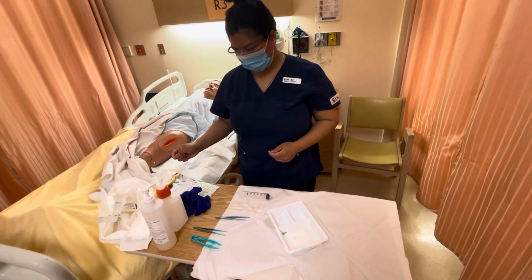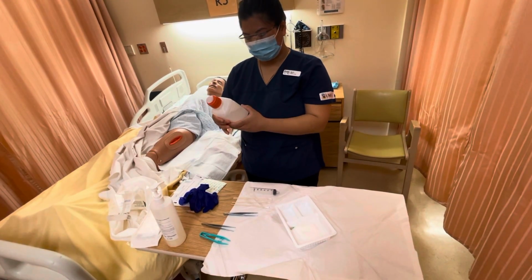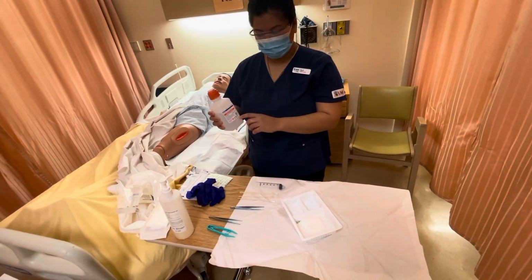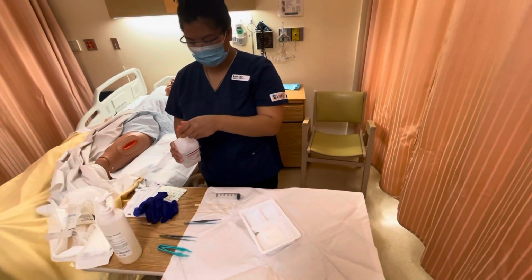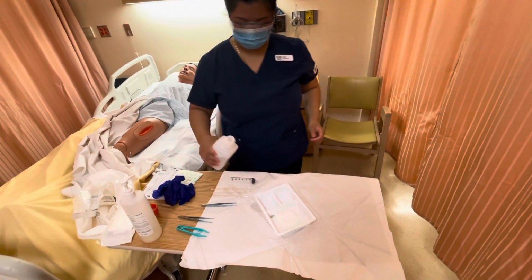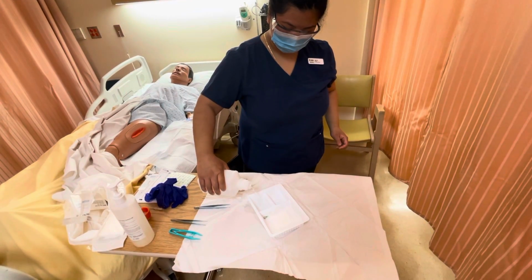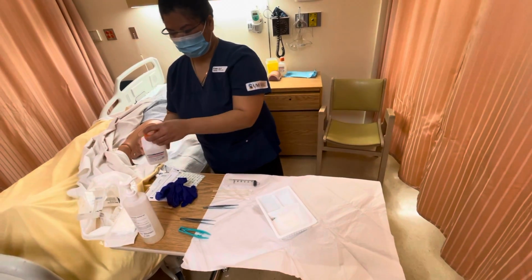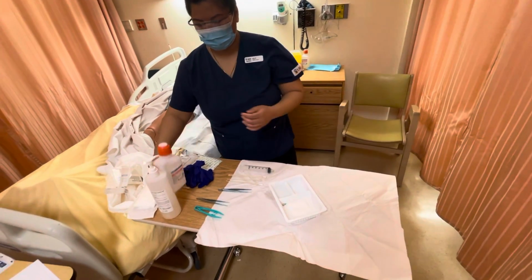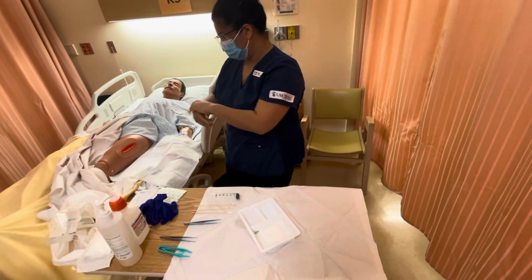And I'm going to pour normal saline solution. So we check that it's not expired yet. I'm going to put the normal saline onto our dressing tray. For the sake of the video, I'm only going to do tape, but in other cases I would be securing. Okay, so we're going to do hand hygiene and put on a set of gloves.